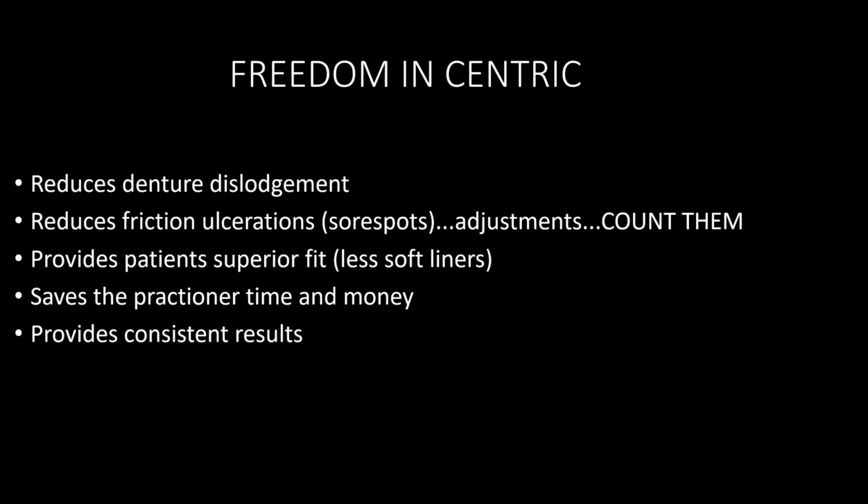So again, you want to watch the chew cycle, and now I've given you some tips on how to identify that chew cycle. So now you can move around those teeth to help with that patient, but I'm using denture teeth that are allowed and can work. It reduces implant damage and denture damage as well.